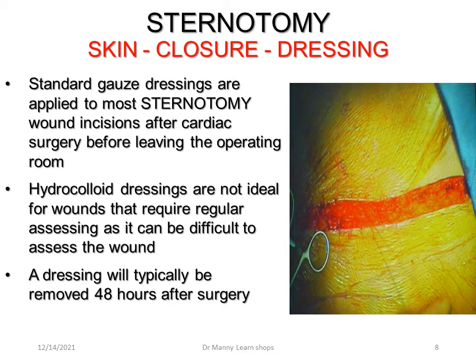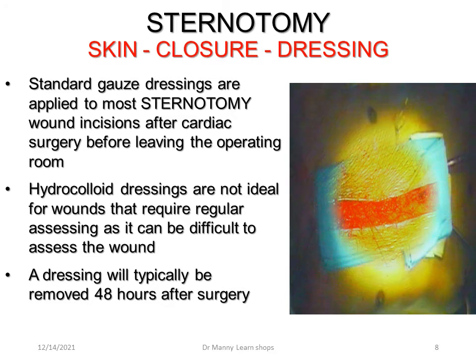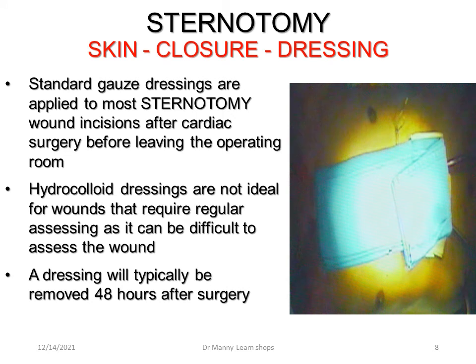So we see skin closure, which is with suture material, or staples, depends on the surgeon preference. A gauze dressing is typically applied.